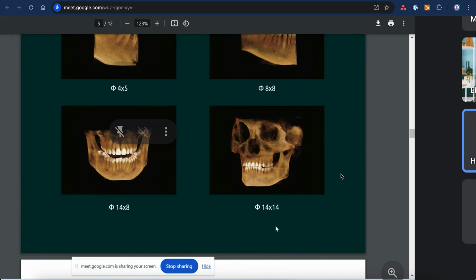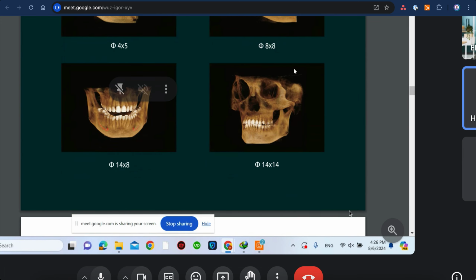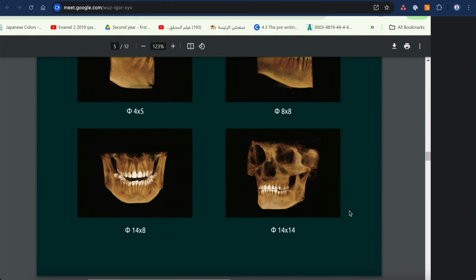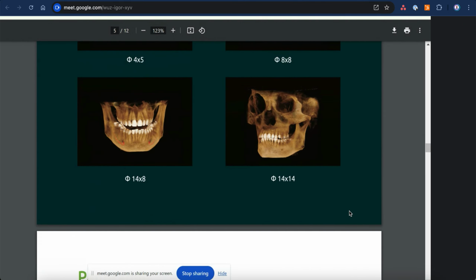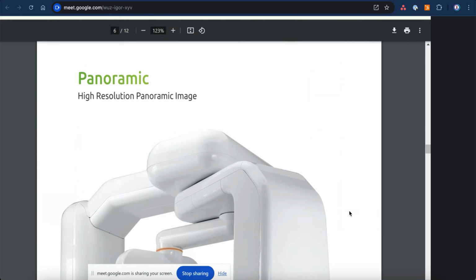I make this rotate, so I can exactly see, for example, if there's something hidden behind the eye, if there is malignancy, or, for example, what a cataract patient may suffer from, so I can use this. Okay, this is the panorama as we have explained before.